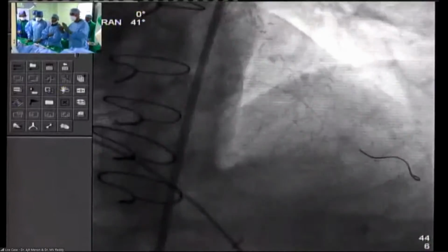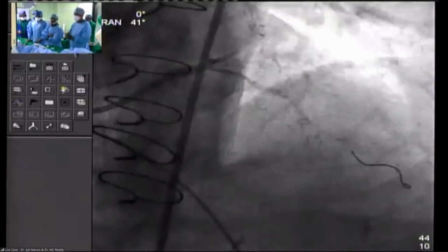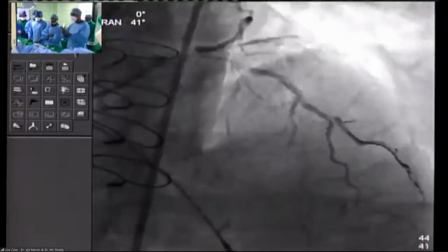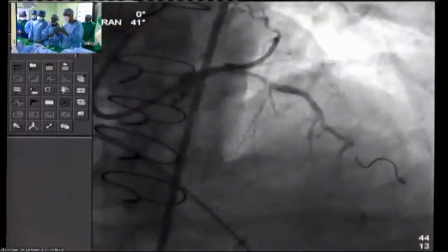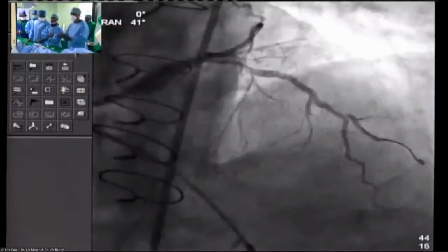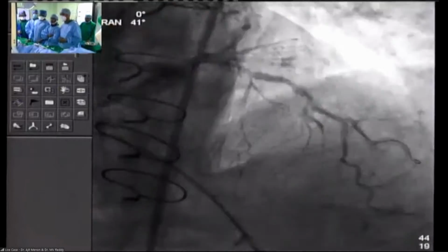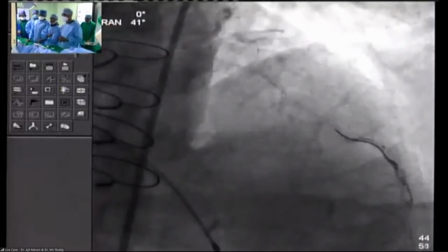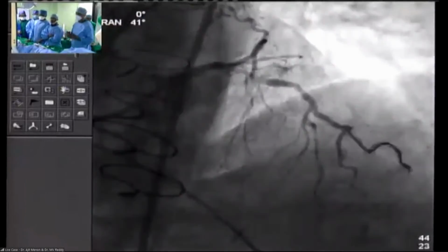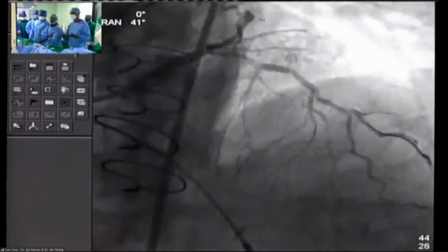And this is what we were left with. So it must be air or something like that. But the flow stopping in the LIMA also, whether it was purely because of hypotension, maybe. That's the reason why the LIMA flow stopped. Or air there, and there's no subclavian stenosis, right? No, there's no subclavian stenosis. Okay, so now can someone suggest what next?